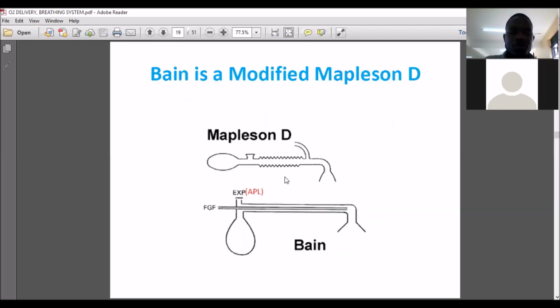So they went to now the D fashion. Now for the D fashion, you breathe in. You see that FGF, that is the fresh gas that you're getting in, okay? Then before you breathe out, some goes to the bag, which is the reservoir, and then another one is going outside. You're seeing the diagram below; it explains it well. We are together in slide 19.